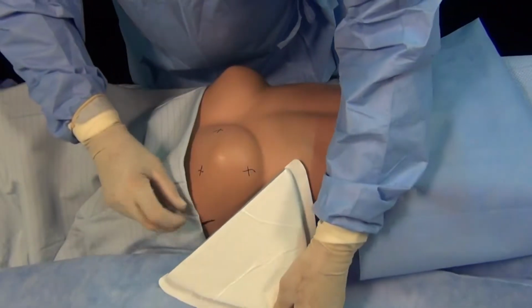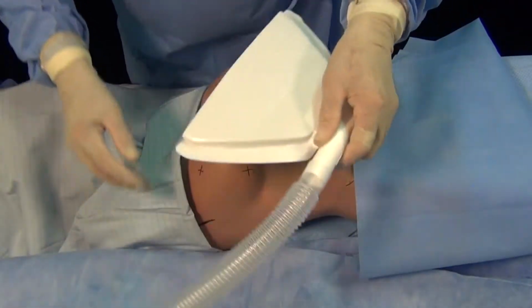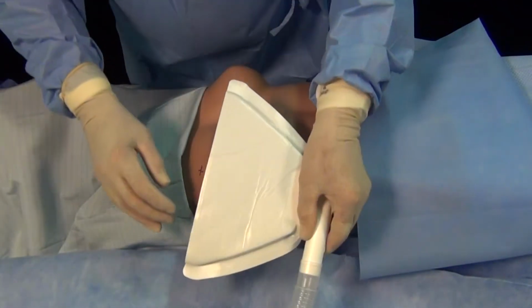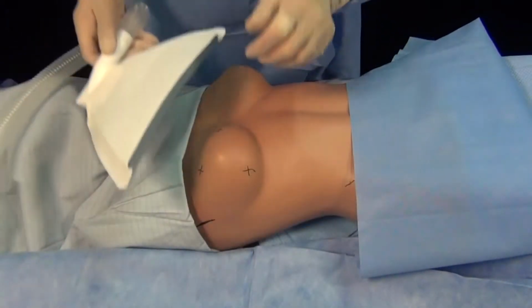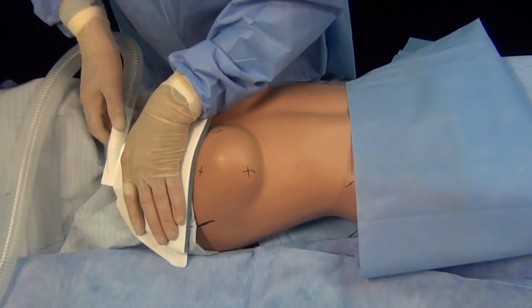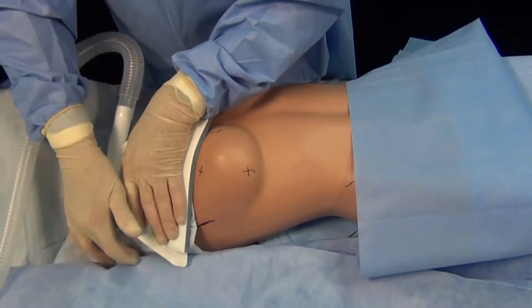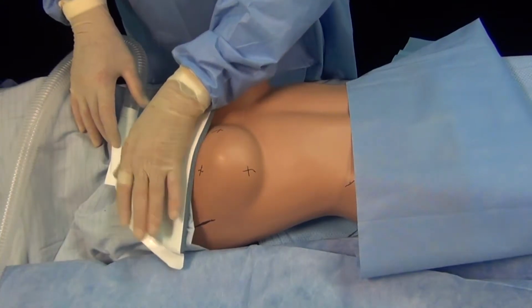It could be positioned inferiorly and do the same thing, or it could be done this way as well. It's always better to take the top side for the incision, since smoke rises. But this would be perfectly adequate for a local excision and sentinel node biopsy.